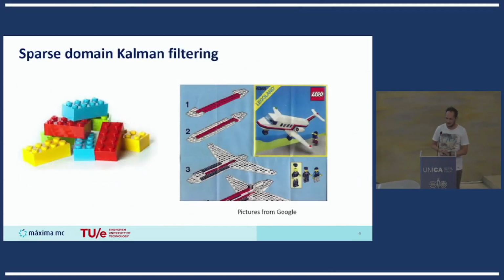And that's where Legos come in. Because we can describe this problem in terms of Legos, because these building blocks, the P wave, QRS complex, can be blocks. And how you combine these blocks together, that's basically the manual if you're going to build something, how you should stack these blocks together. And that's actually what we're going to exploit.